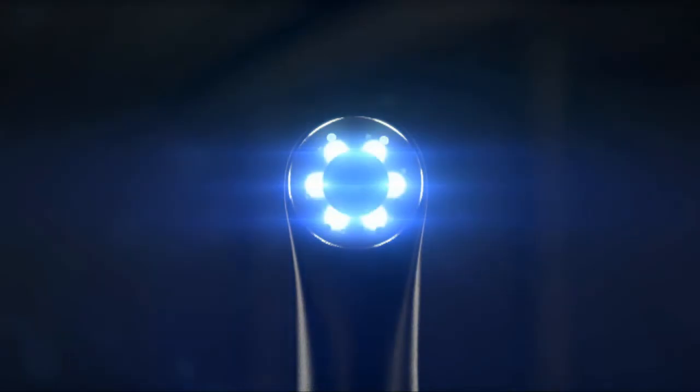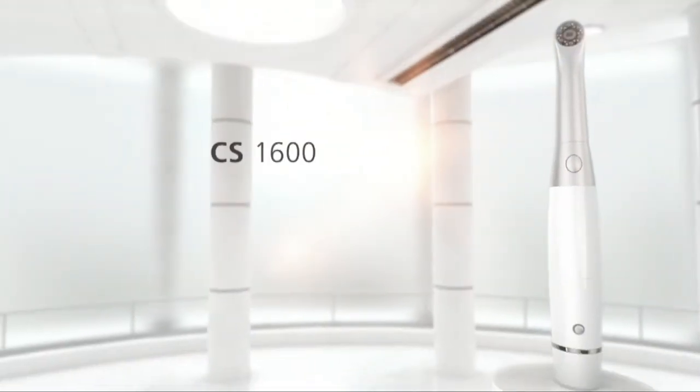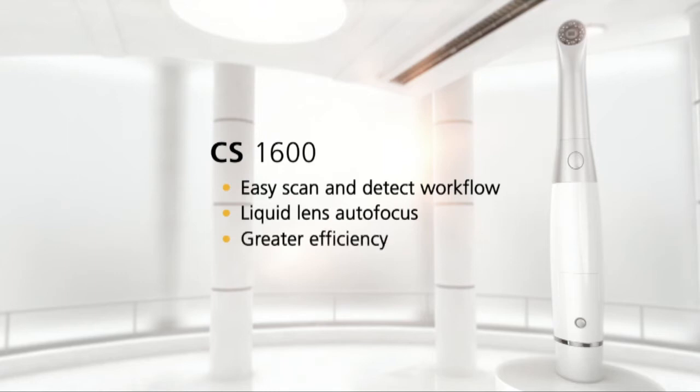Shine a light on caries with the CS1600 intraoral camera from CareStream Dental, a leader in dental imaging. The CS1600 combines superior image quality with unparalleled workflow for effective non-invasive caries identification. Featuring an easy scan and detect workflow and liquid lens autofocus technology, the CS1600 offers greater efficiency and better patient communication.